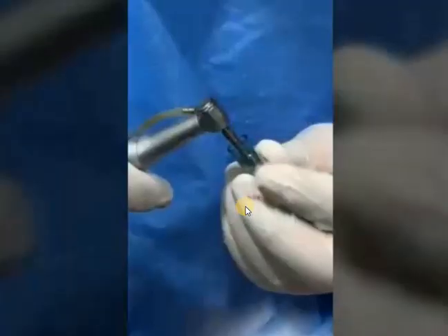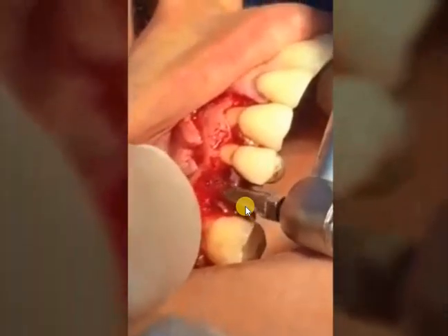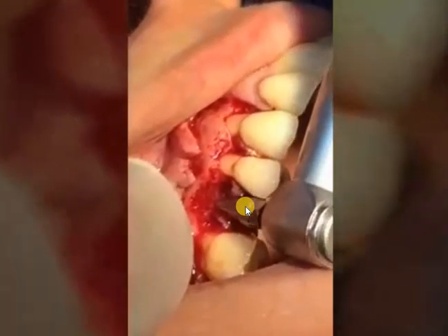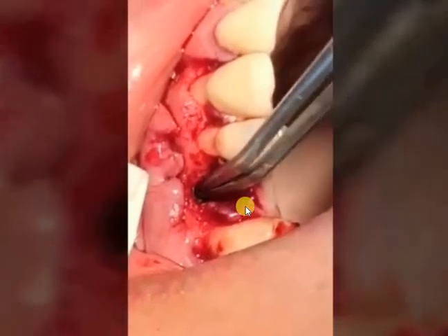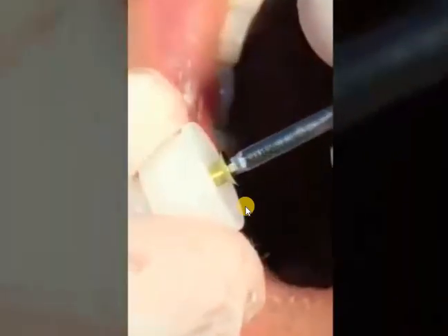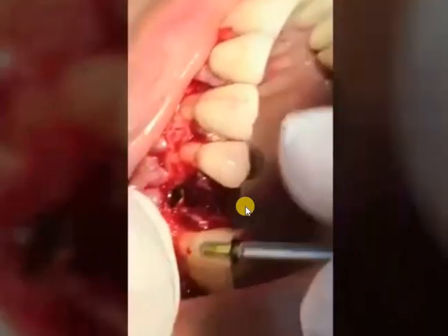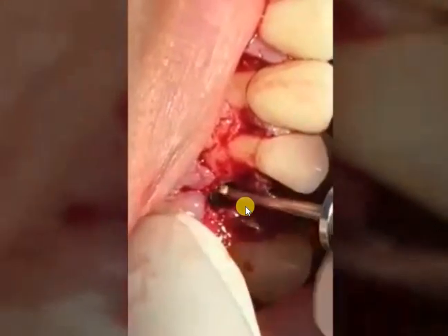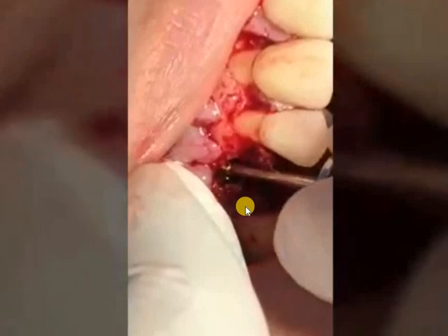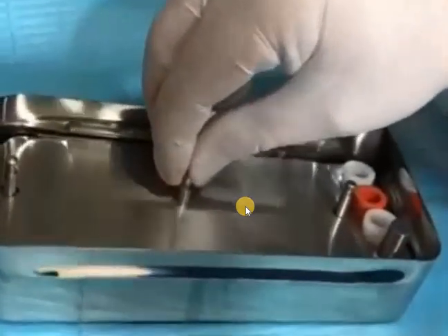It is better not to touch the fixture with your hands — just cover it and hold it with the fixture placement forceps. Advance it until primary retention is achieved. We check the stability, then place the cover screw on top of the implant, because we are using bone graft in this area and we don't want material trapped inside the implant fixture.